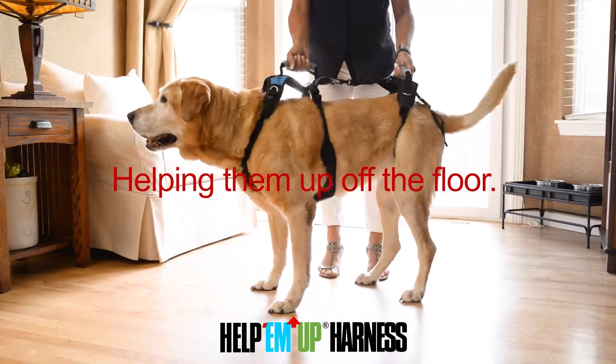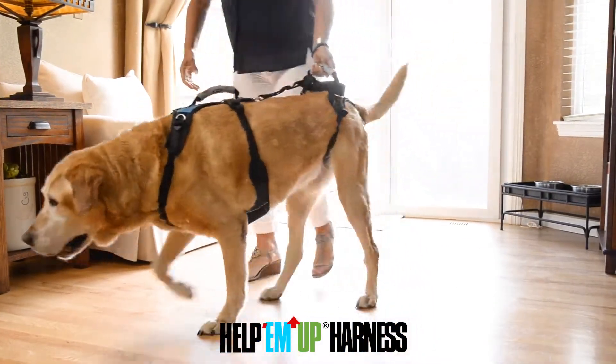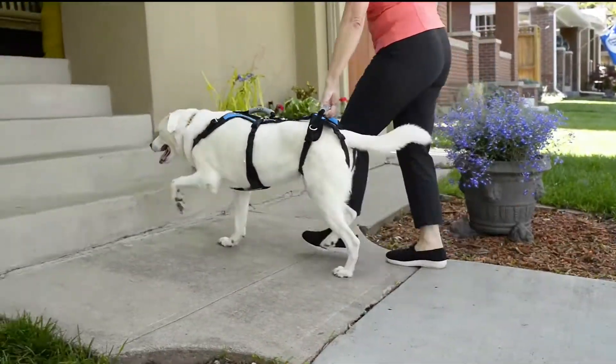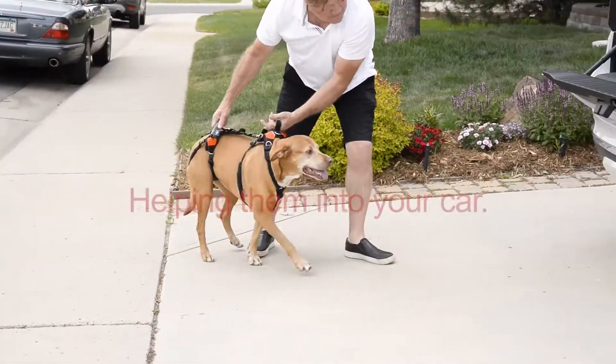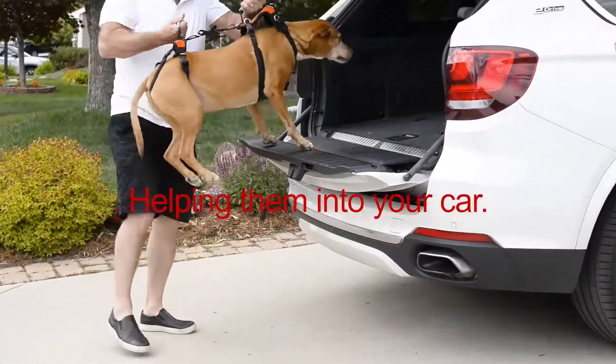Let me introduce you to the Help'em Up Harness — the first full body harness designed to let you lift your aging, injured, or recuperating dog up off the floor, up and down stairs, or in and out of vehicles.